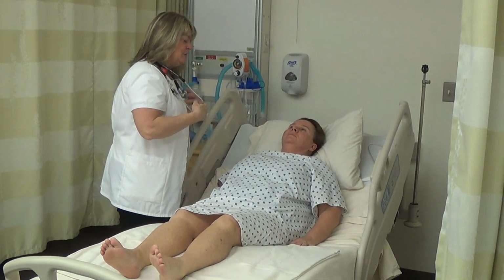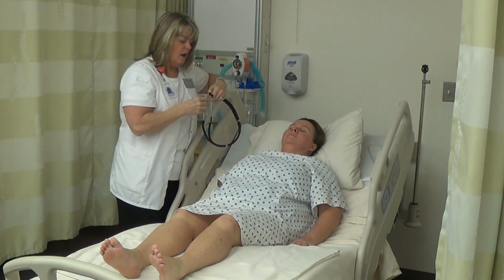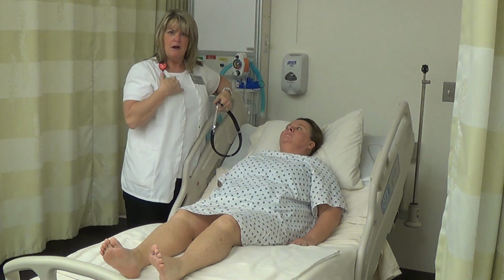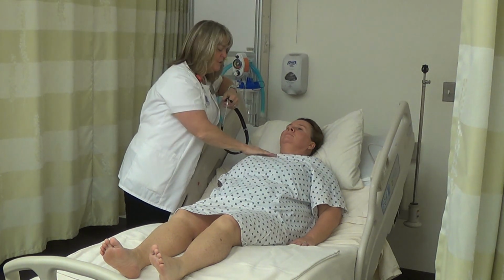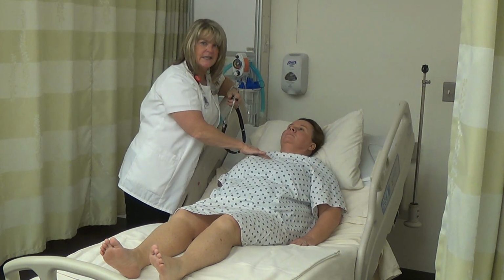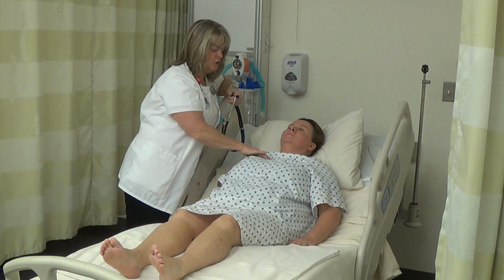The first thing that I'm going to do is listen to her heart sounds. And with this, you need to memorize where their heart valves are. So you need to start palpating either yourself or your honey bunny at home, and you need to learn to locate. So we're going to learn to count intercostal spaces. So the first place we're going to listen to the heart is the second intercostal space. So you roll over those ribs, 1, 2.